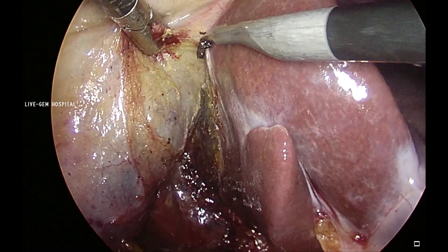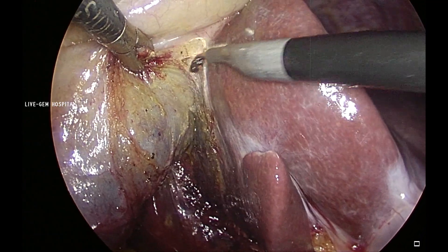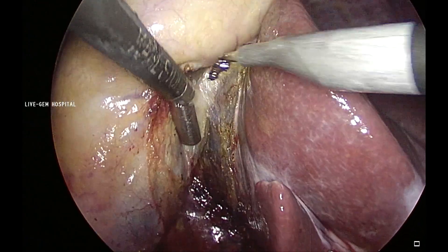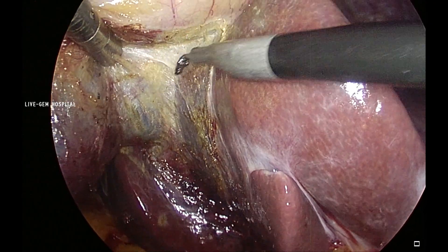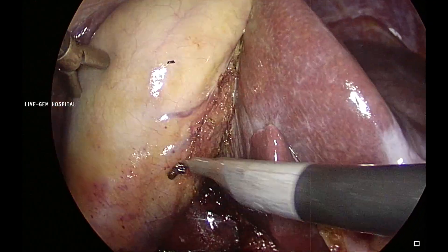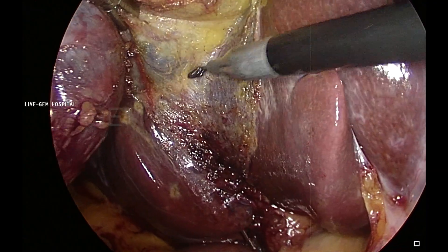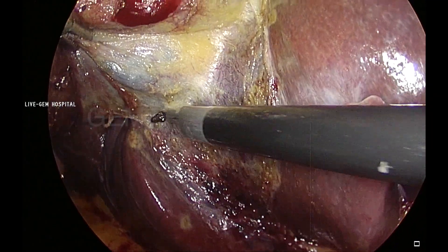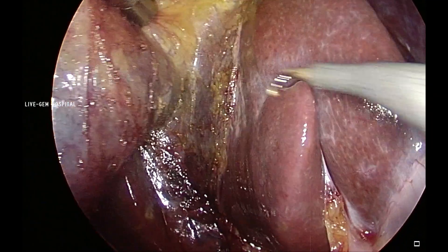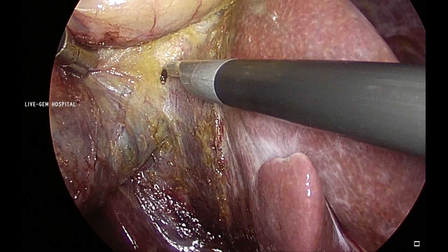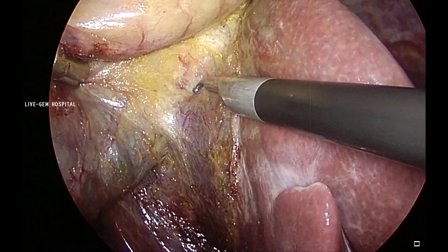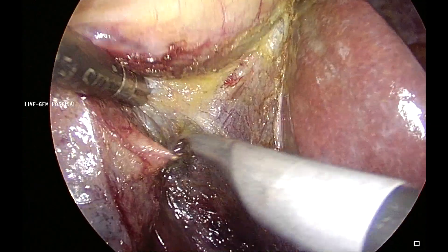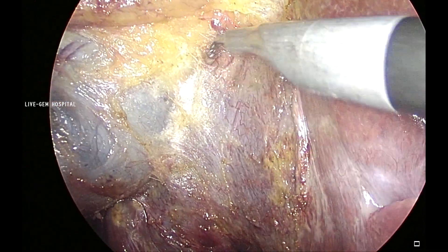If you see all my videos — hernia, fundoplication, tap gallbladder — the left hand plays very actively compared with the right hand. If any surgeon develops the skill of using the left hand very casually and effectively, they will be able to do any laparoscopic surgery. Now I am going towards the fundus. The left hand is called the active hand in any laparoscopic surgery. Here I am going to the posterior wall towards the right side. Each time I touch the gallbladder, I retract it a little with the hook and change my left hand position. The posterior wall fundus has fat but the mesentery is very thin.